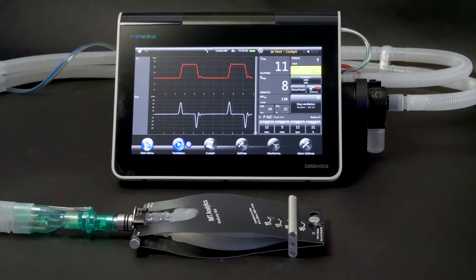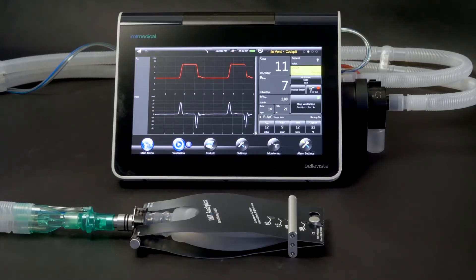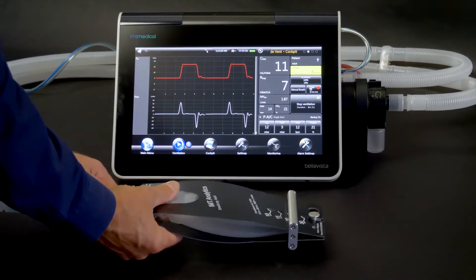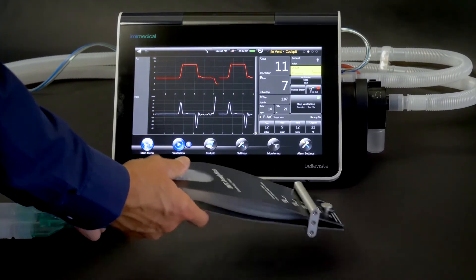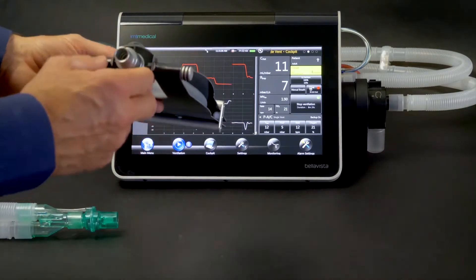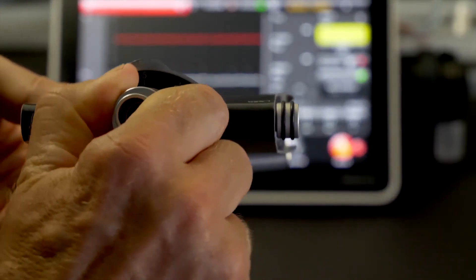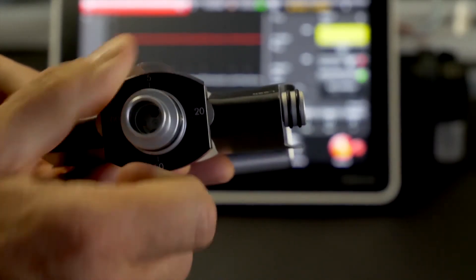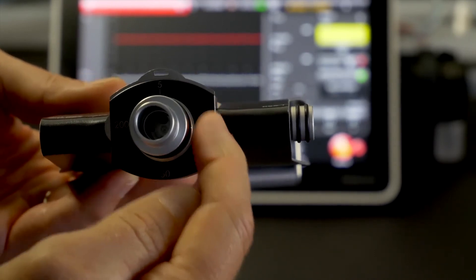The easy adjustments of compliance and resistance make the Test Lungs a compact and user-friendly tool for your daily needs. Different airway resistances can be simulated by simply turning the connector. Resistance can be varied between RP5 and RP200.